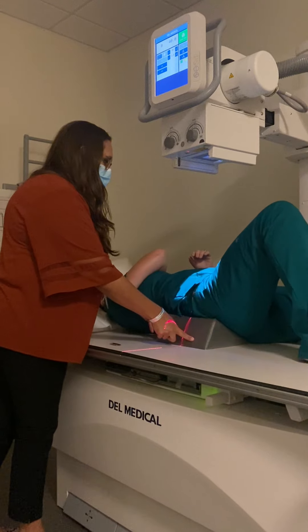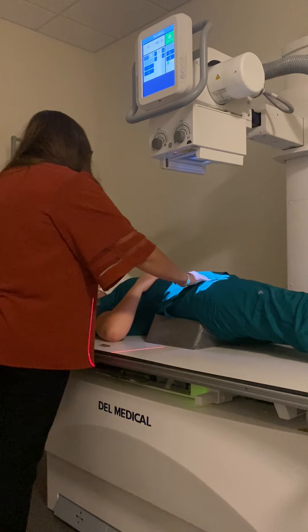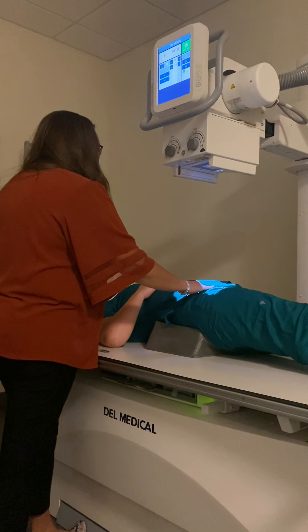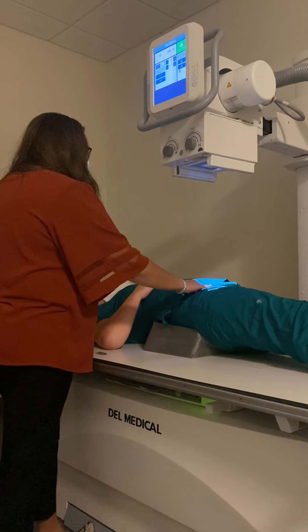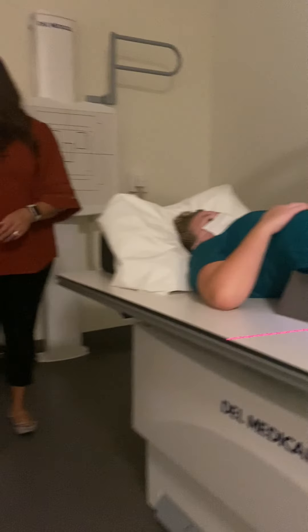Sponge underneath you there, go ahead and roll back on your hips, straighten your leg out. I'm going to find the upside ASIS and center at the level of it, one inch medial. I'm going to use my right marker for this one, and I would have my patient hold their breath.